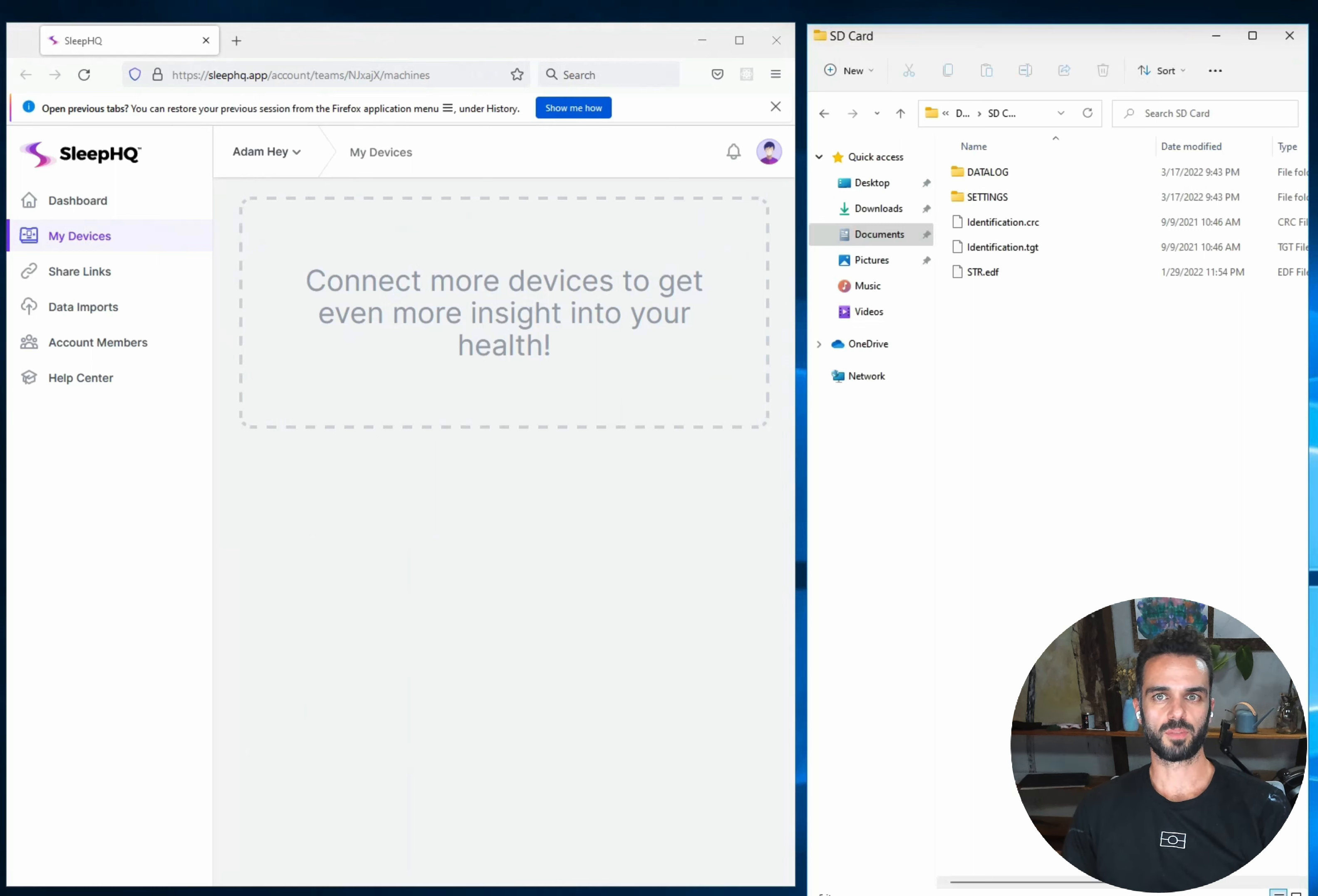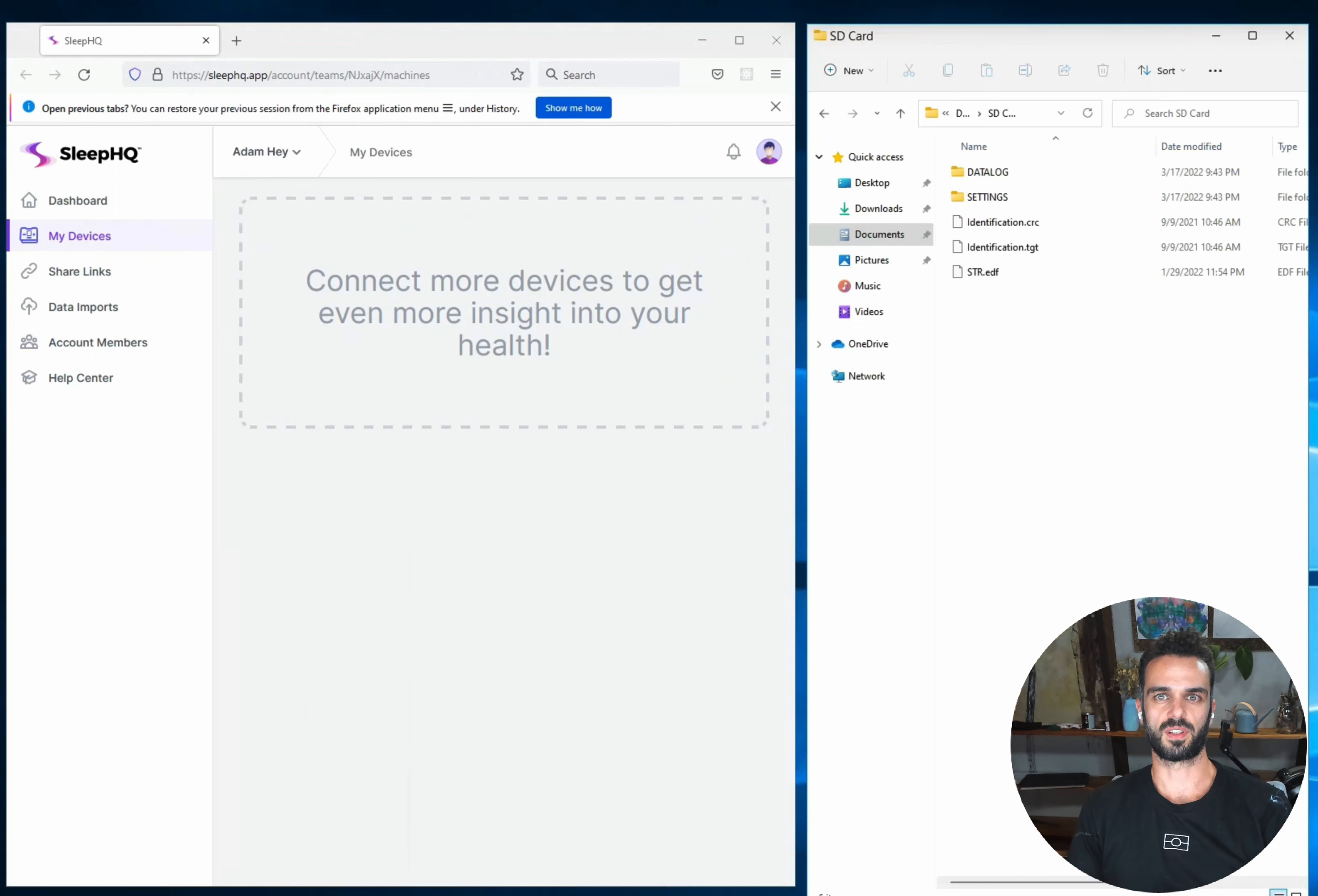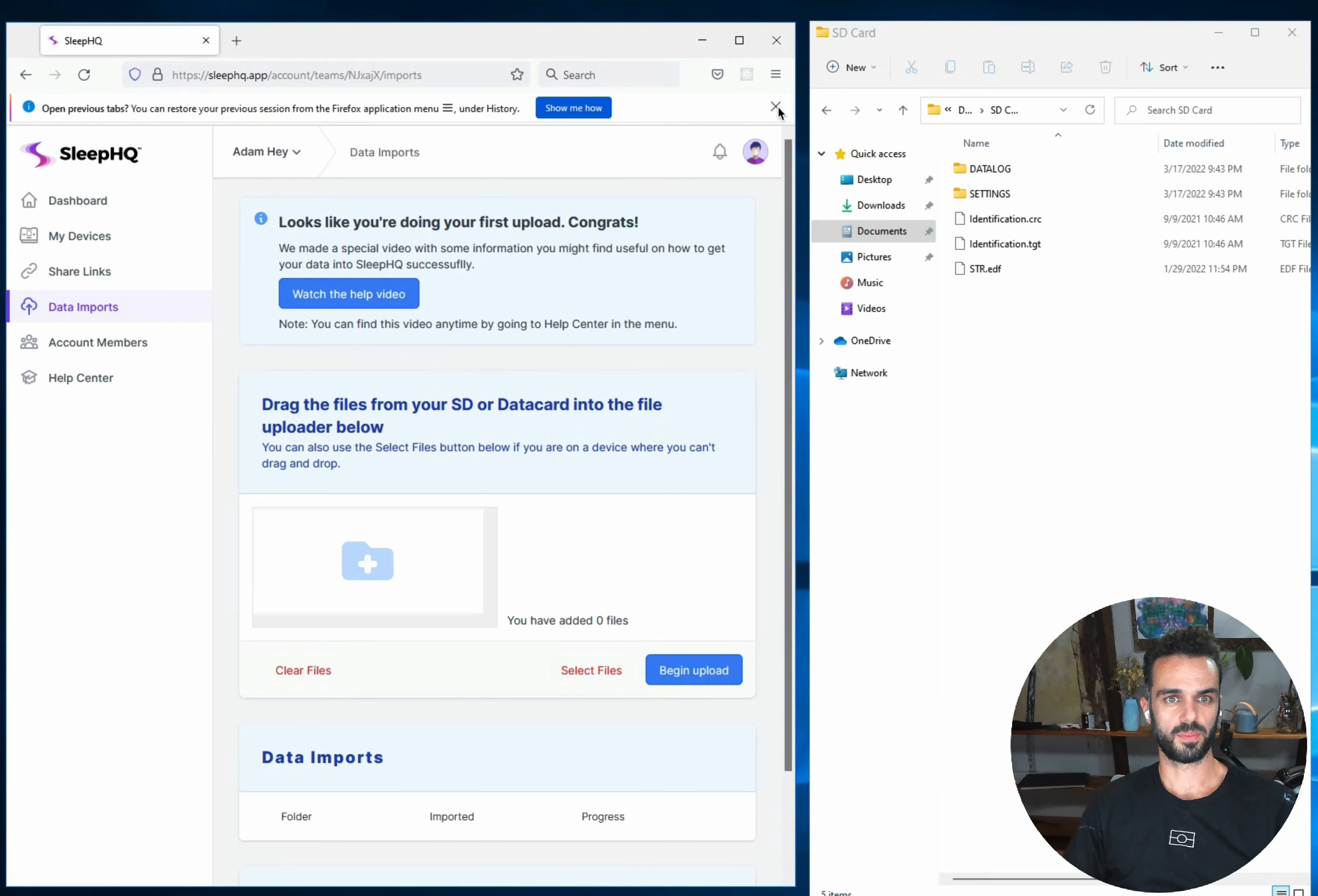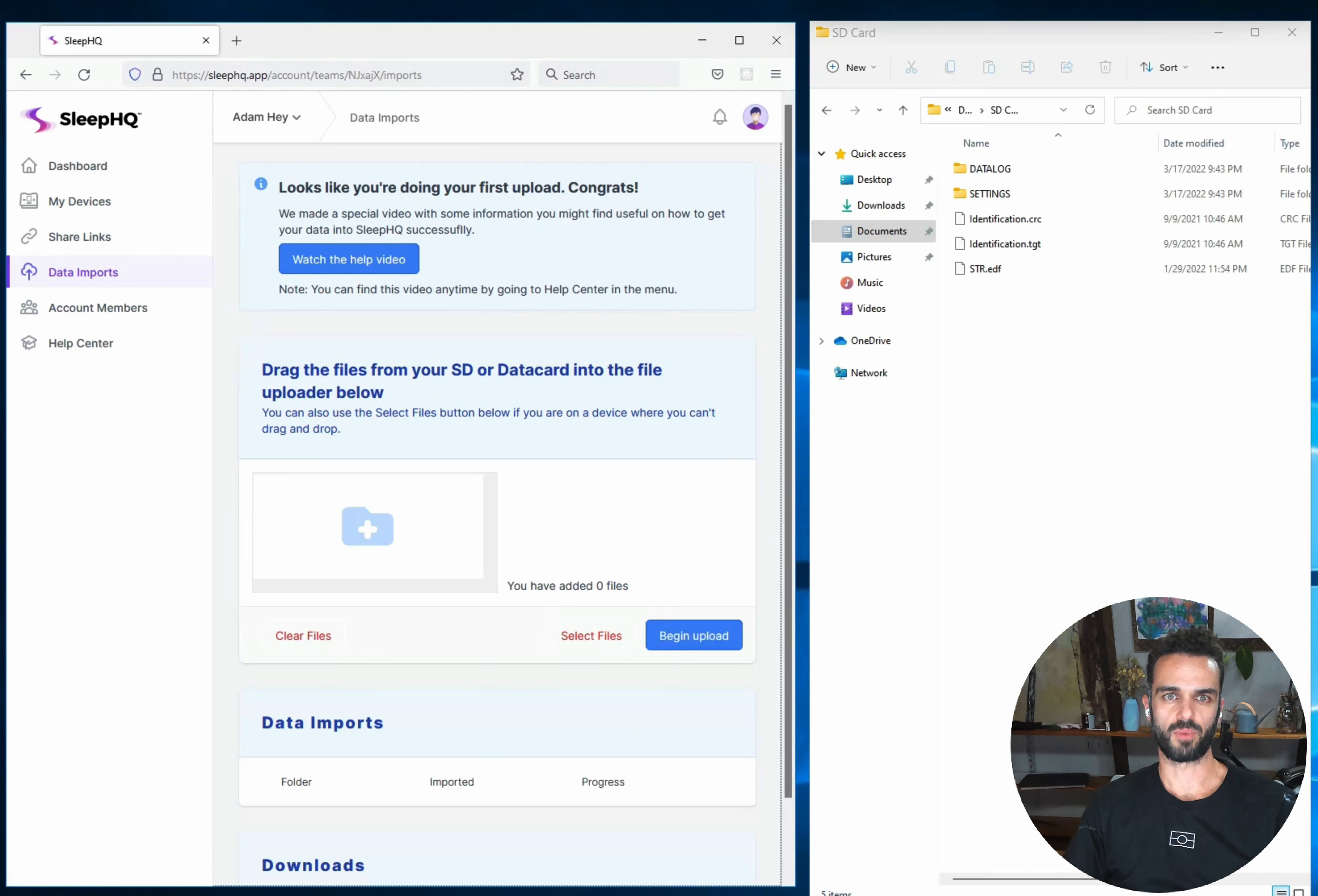I'm on my Windows machine today. The last video I did was on an Apple computer so I wanted to do the video today on Windows so you can see exactly what it's going to look like if you're using a Windows computer too. Okay so to start with I've got two windows open. On the left hand side here I've got my internet browser. I'm using Firefox but you can use Chrome, Safari, Edge, any of the main browsers will work.